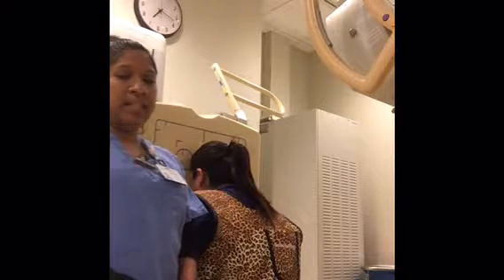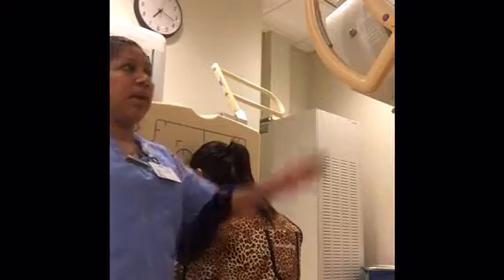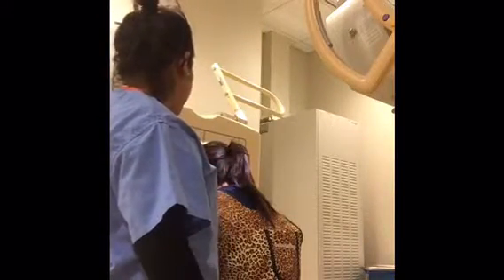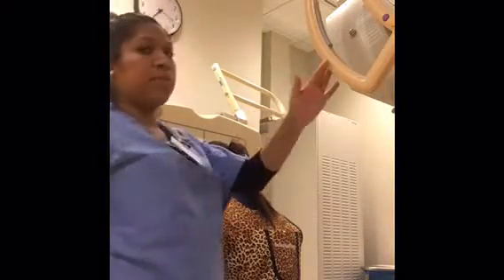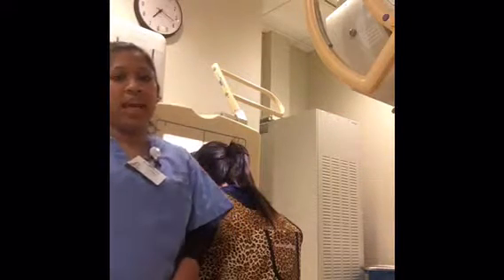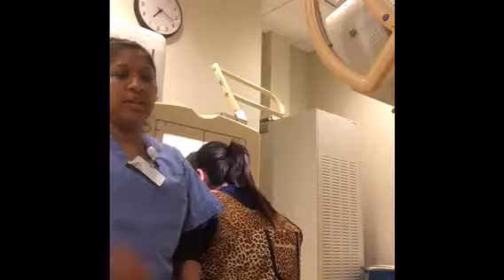Our central ray exits at the nasion, and we see that we have a 15-degree caudad angle. So that's for the central ray. We see right here it's going to exit at the nasion with a 15-degree caudad angle. And our technique that we are going to use is 85 kVp at 14 to 16 mAs.